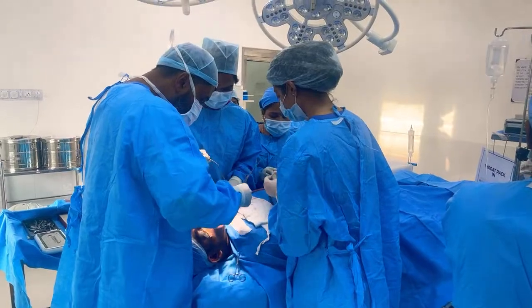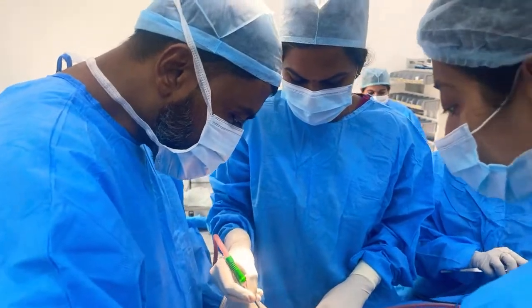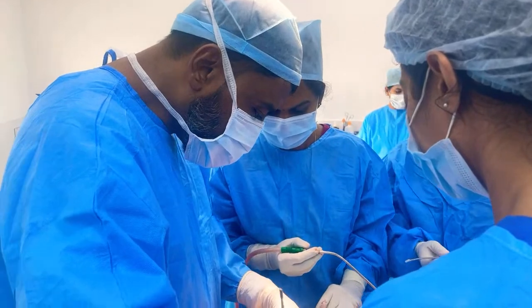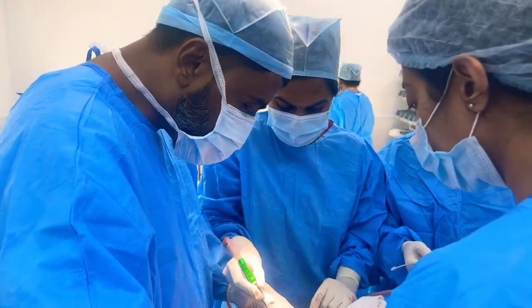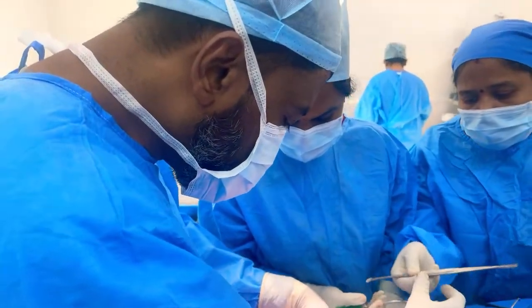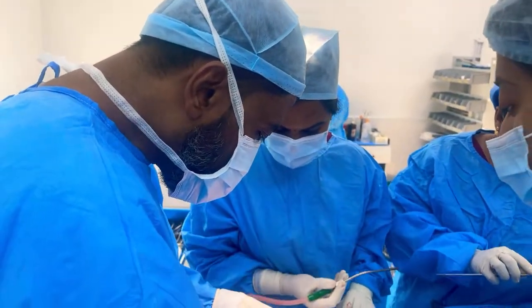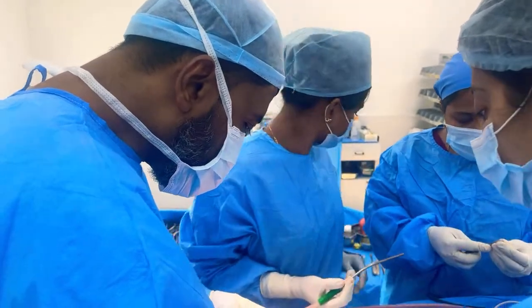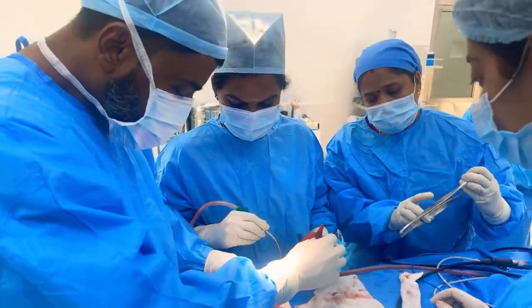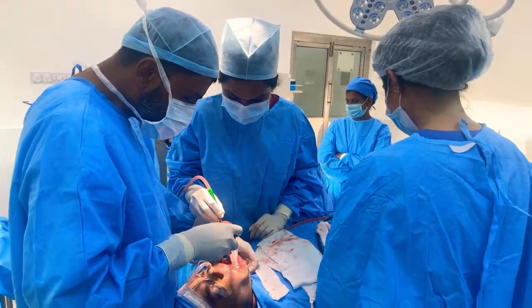So when we cut bone, the bone tends to ooze a bit, and I know you can't see that, I don't want to show you, but I'm using something that's white. We call this bone wax. Bone wax is essentially prepared from honeybees wax. We don't prepare it, but the company makes these bone wax, but very useful to, you see how it stops bleeding? It gives you a nice clean area, and also because it's less bleeding, then the healing is faster also.